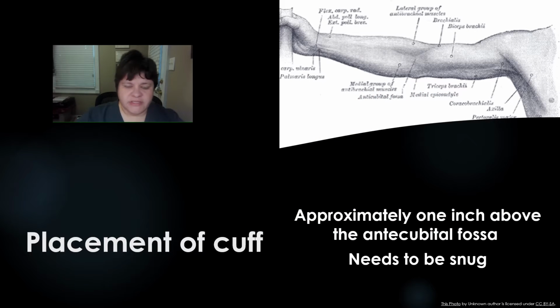Now let's take a moment and discuss where you place your cuff. There's a couple of different places you can put it. If you're doing a manual, the best place to put it is going to be about 1 inch above the antecubital on either arm. And that's assuming that there's no restrictions against using that arm, such as lymph node removals, wounds. Obviously, if you have an IV access, you don't want to put it there. But typically, if you use that, then you can take a manual cuff pressure using that location.